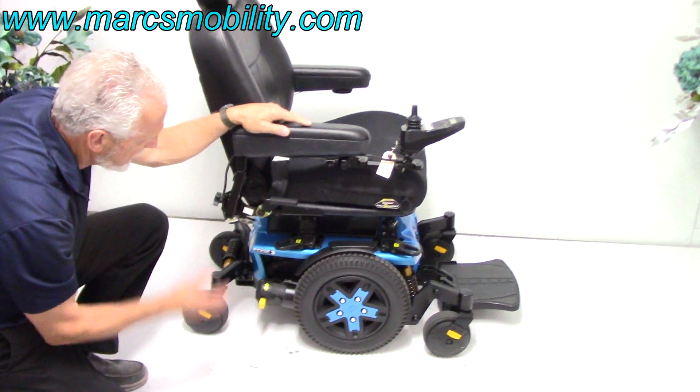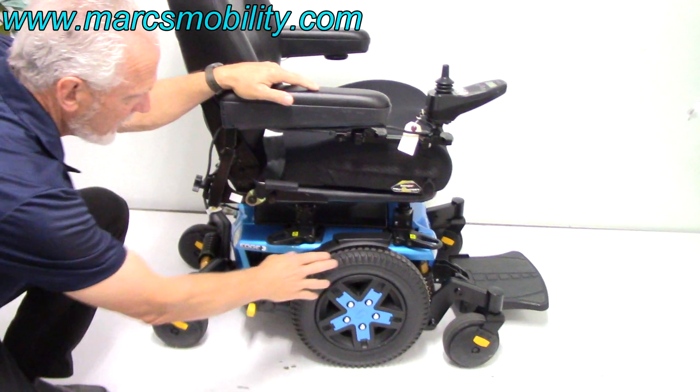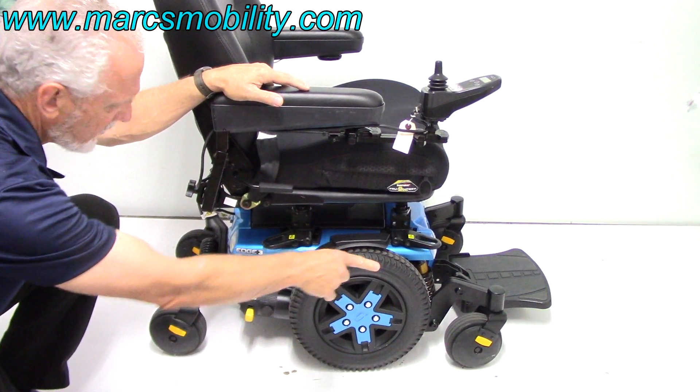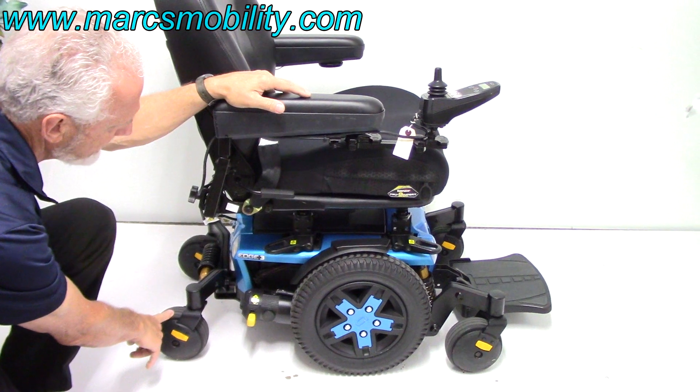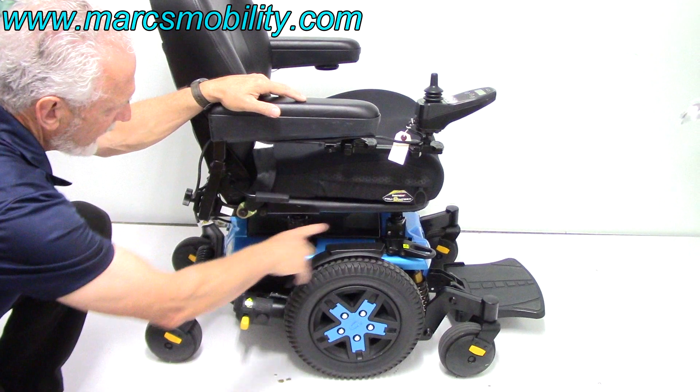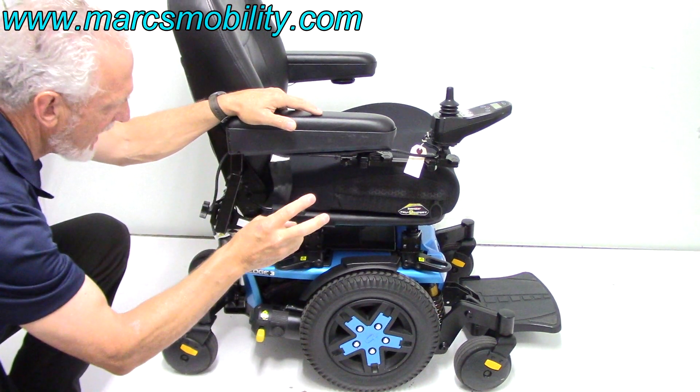The base here is beautiful. We've got 14-inch black non-skid wheels with caster wheels in the front and caster wheels in the back. All Quantum Edge chairs have the super anchor points — one in the front, one in the back, and two on each side.